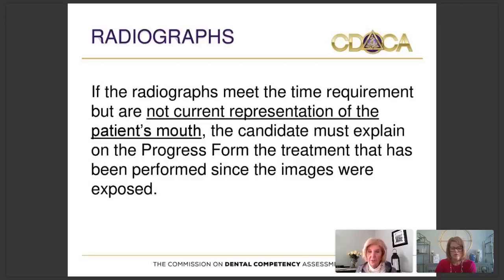You don't need to re-expose the patient or re-expose the radiographs. All you need to do is on the progress form, on the front under the candidate notes section, just write and explain the treatment that has occurred since the radiographs were exposed. So by looking at the radiographs and by reading your notes, we will have the current depiction of the patient's mouth.